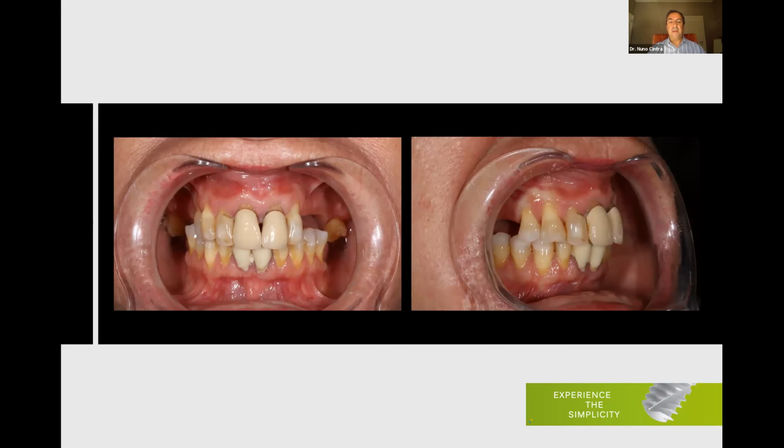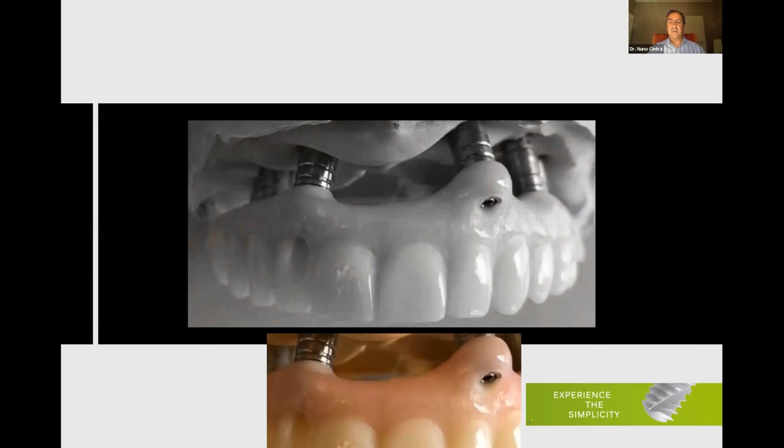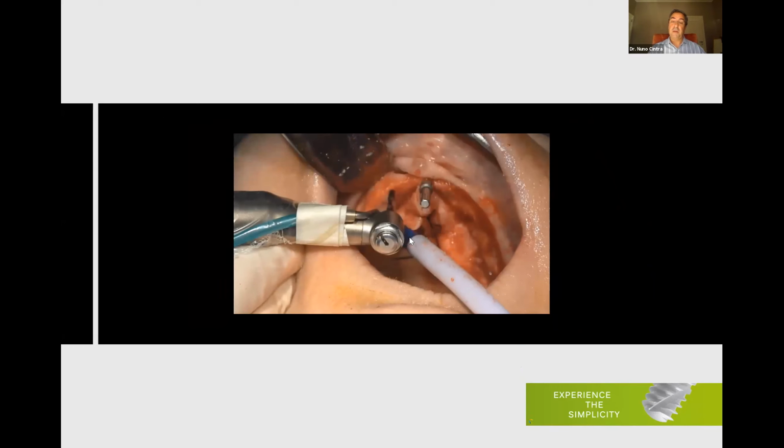And of course, anatomy, we have to follow the anatomy, and sometimes it can be tricky, because in a very flat maxilla like this one, these things can happen. Of course, this isn't acceptable, and we will have to change the abutments for angulated abutments, but that is due to the anatomy. That's what we have. We cannot change it. Of course, in some cases, we can overcome some anatomical defects, but most of the times we have to follow the anatomy.